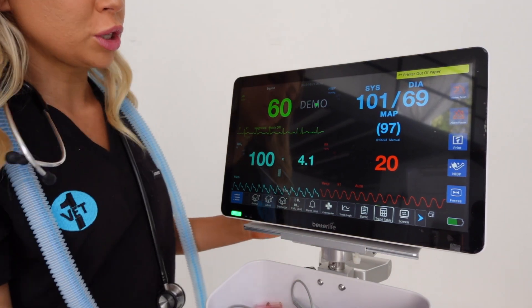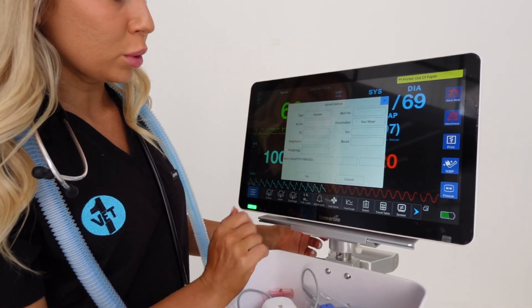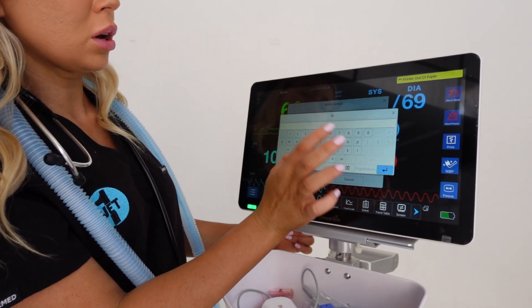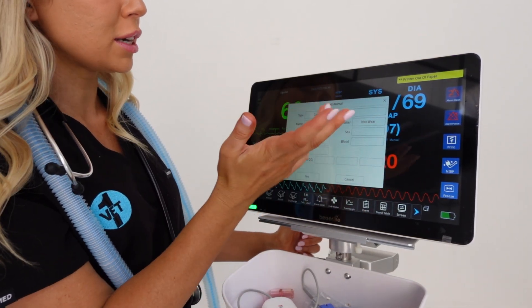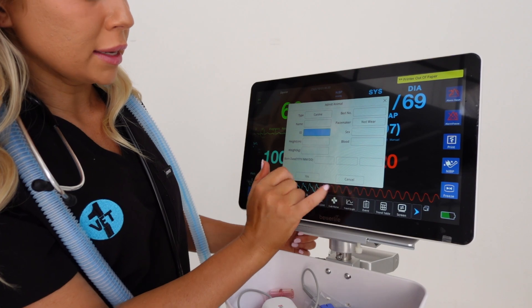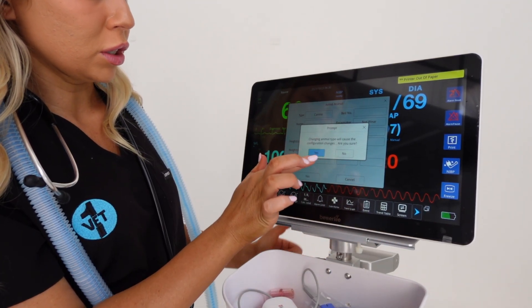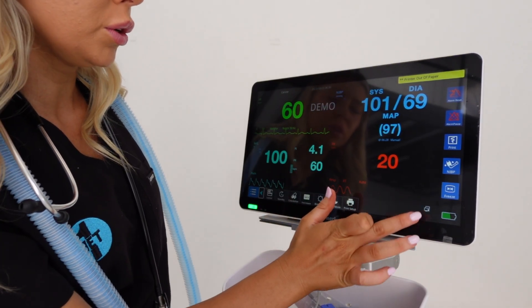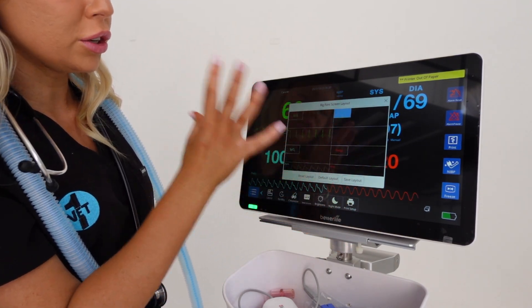If you want to change the patient options - whether it's a cat or a dog - you go to animal. It's currently set to horse, which it is not, so I'm changing it to dog. You can put in your patient ID to track it on their patient file, then the name, weight, and anything like that.